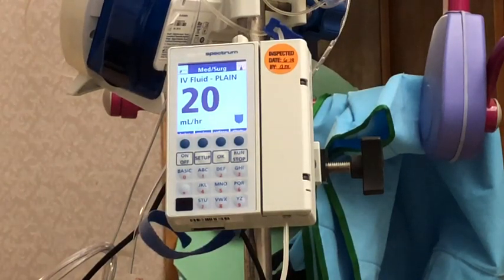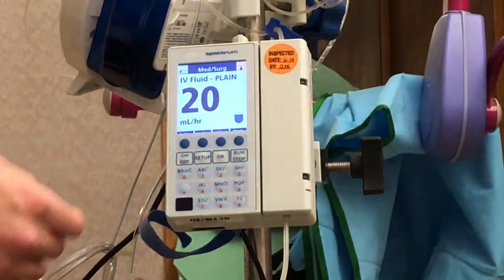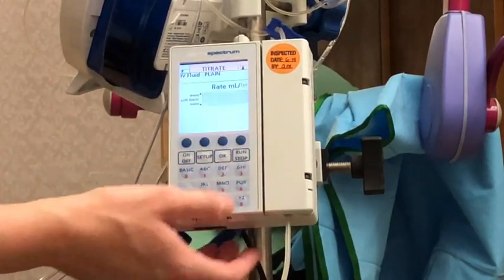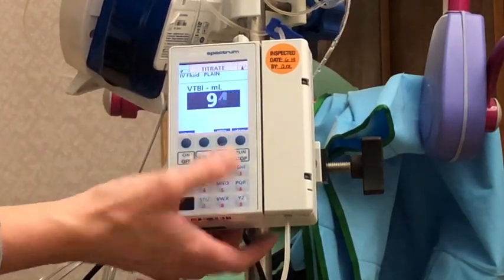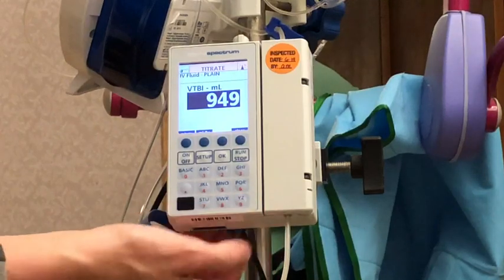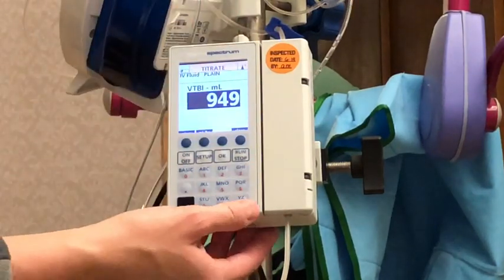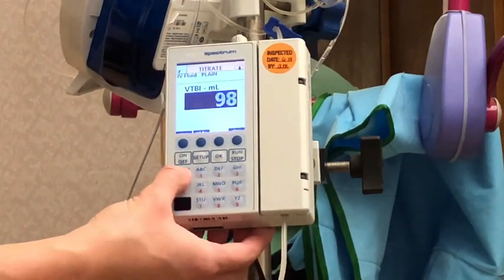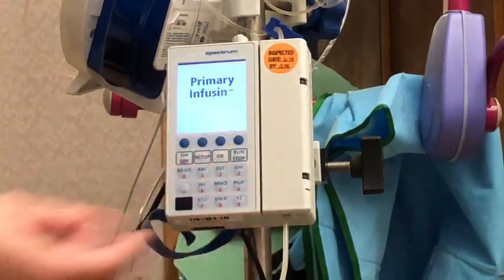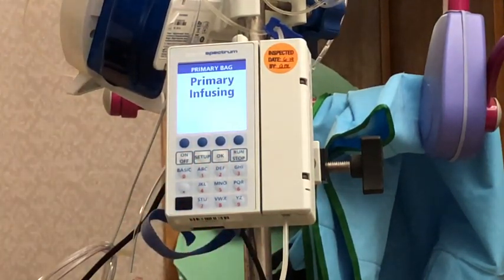Now if I wanted to change the volume to be infused — let's say this is running and the bag is empty and I need to change the bag — I can go into titrate and see the VTBI down here. I can hit that and change it to my new bag amount. I'll switch that to 980 and hit okay, and that will change my volume to be infused.